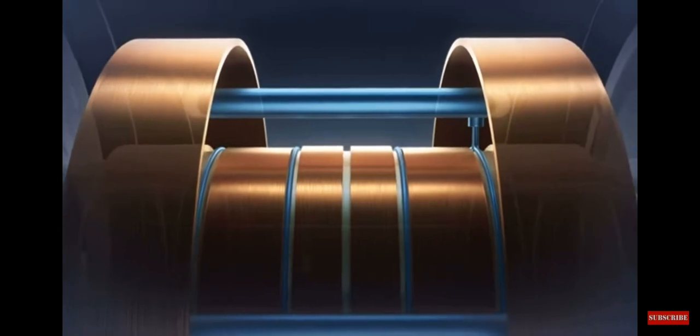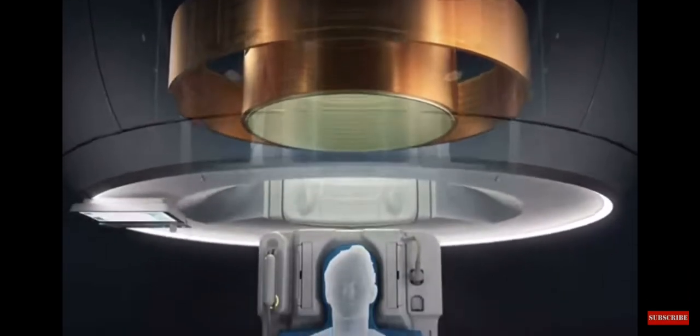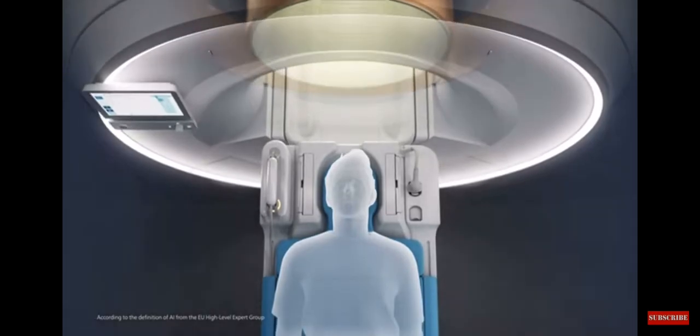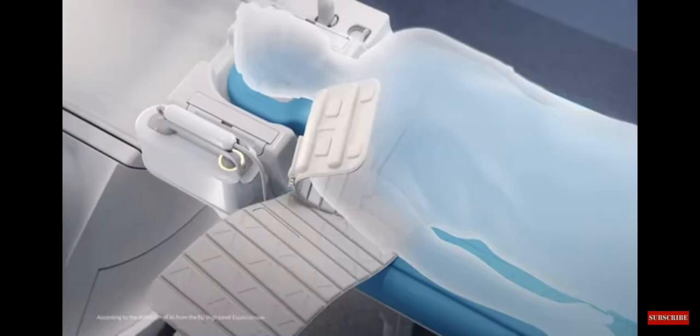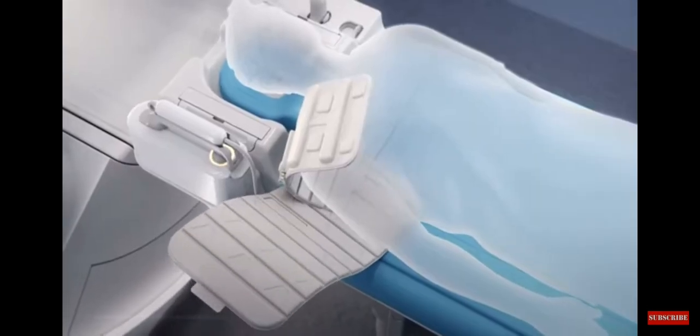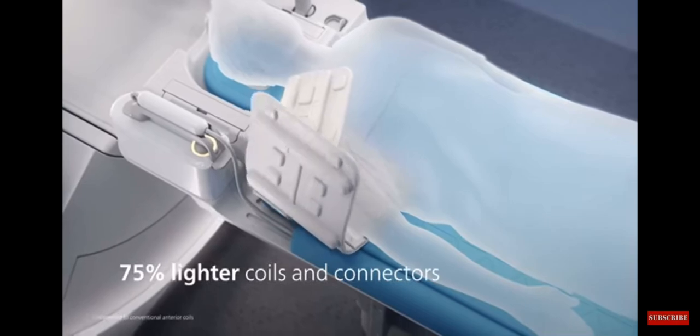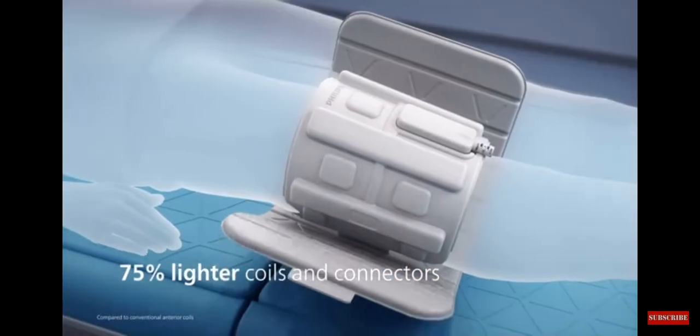It takes our revolutionary helium-free MR operations to the next level with AI-driven breakthroughs designed to automate the most complex tasks so you can focus on your patients.